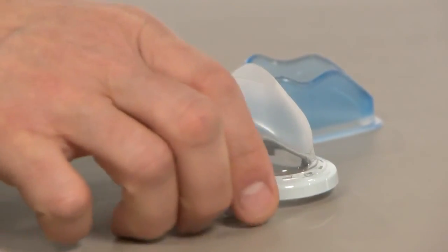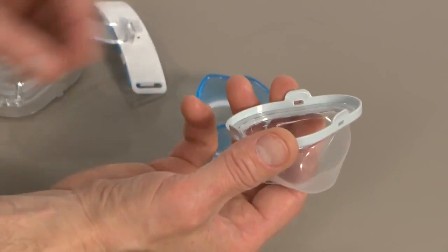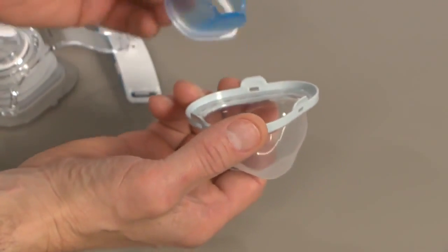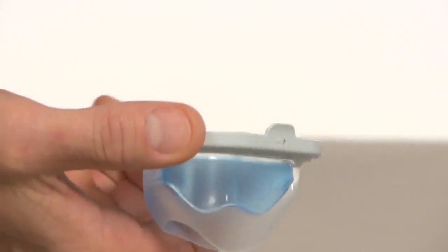To reattach the flap and the cushion to the True Blue mask, hold the flap with the attachment tabs facing up and the size indicator on the left and place the cushion inside the flap so it lies flat.